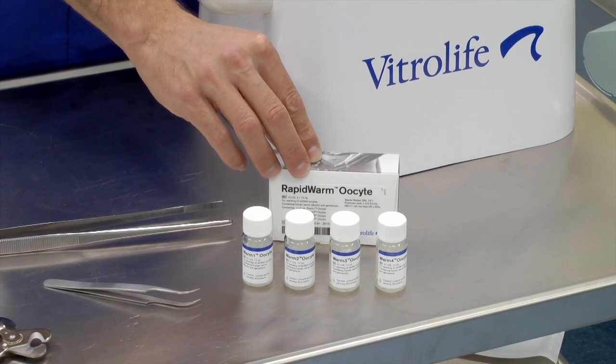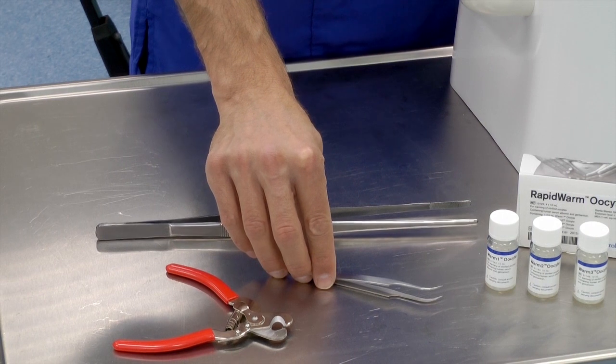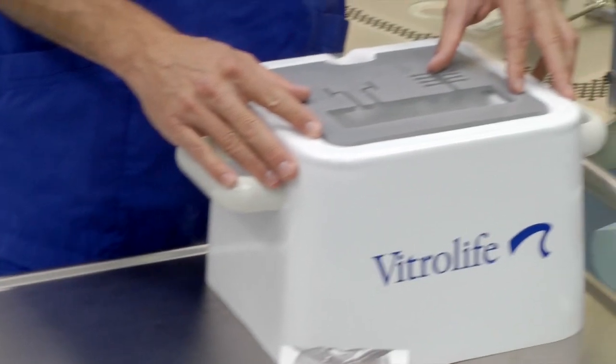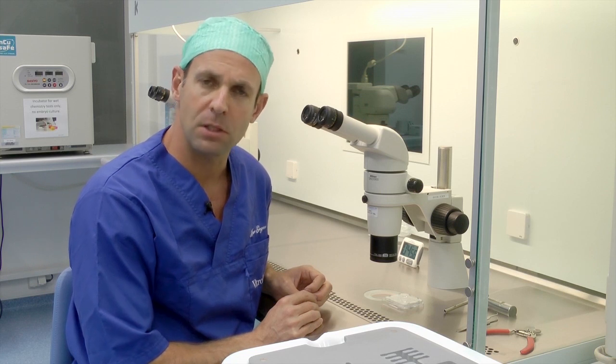To warm the oocytes we need the following: the RapidWarm kit containing four solutions, the large forceps to hold onto the straw, the needle nose tweezer to pick the RapidEye out, the cutter to open the straw, and the smart box containing the liquid nitrogen that will hold the straw in position. The warming procedure is performed at 37 degrees Celsius and ambient atmosphere. Use one milliliter of each of the warming solutions to prepare your dish.